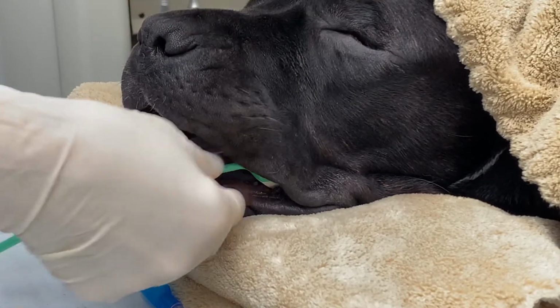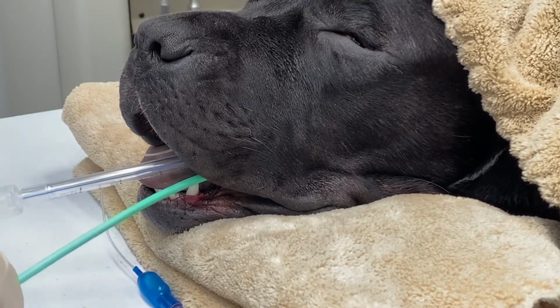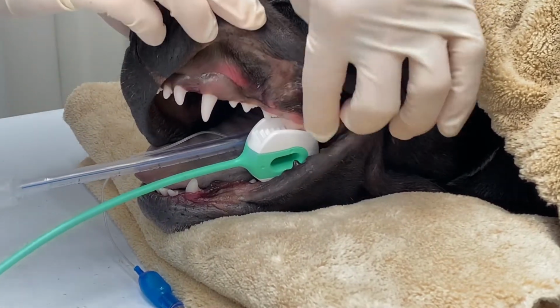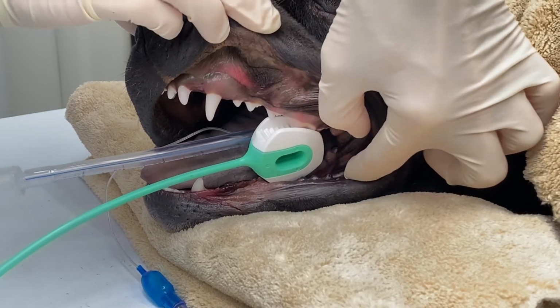crowns right along the ridges here. Very easy to position with the tether coming out of the front of the mouth. And now we're ready to acquire the images on the patient's right side. Here's what that looks like close up.